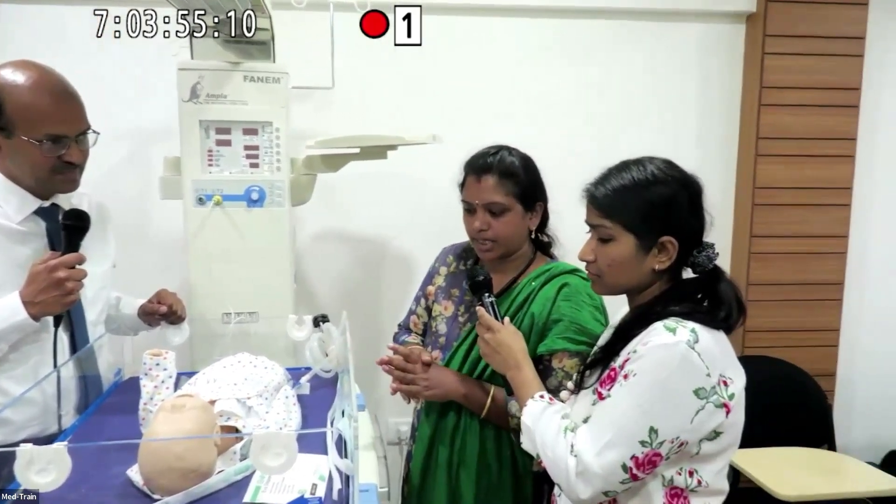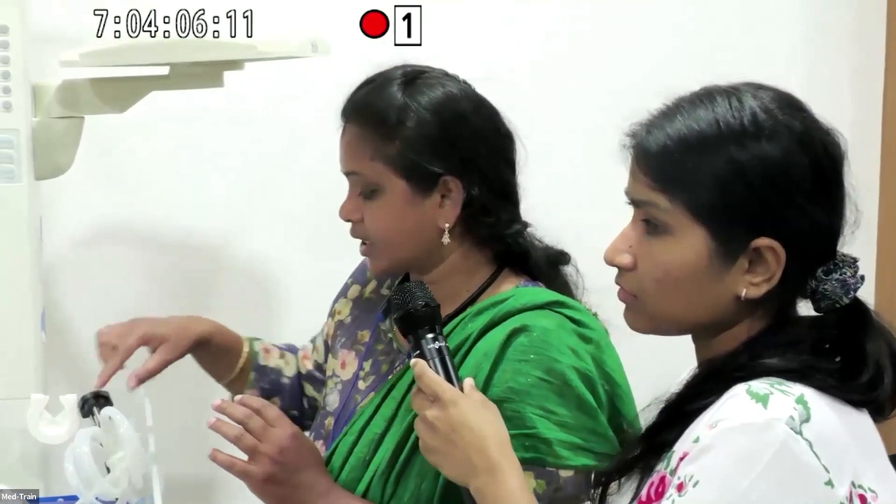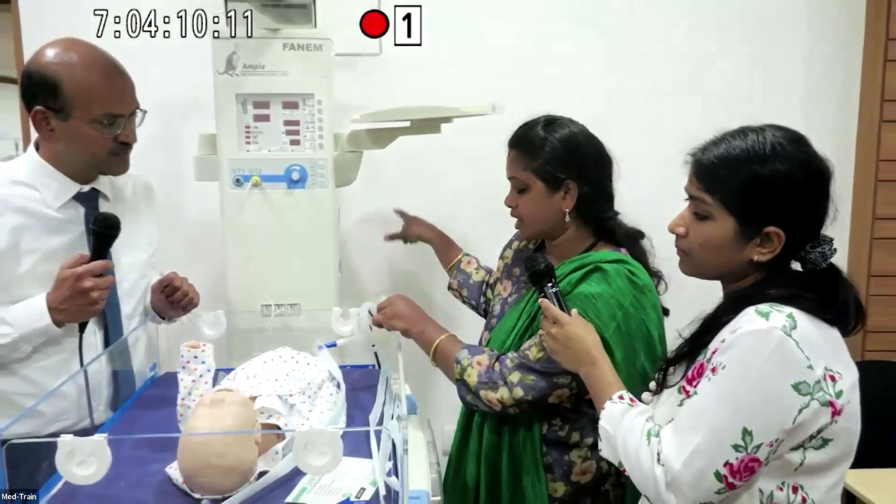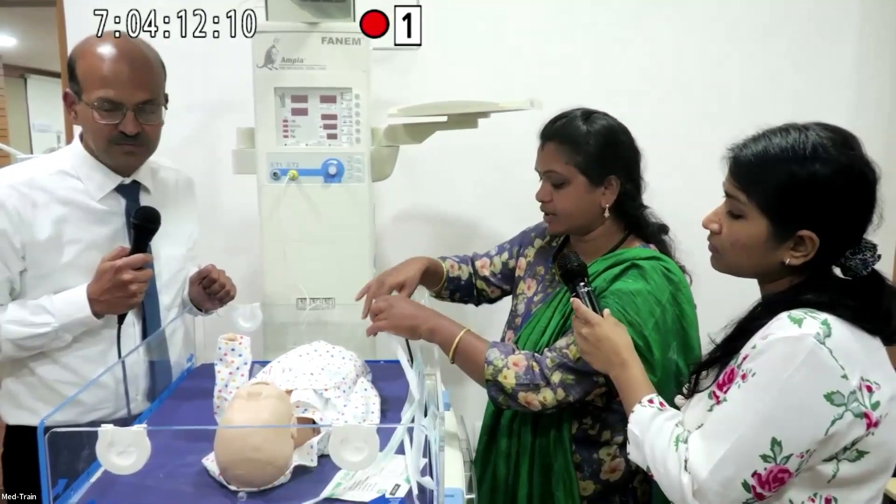Good evening everyone. Before suctioning, the first step is hand washing. After hand washing, with clean gloves, you need to connect the suction catheter and keep it ready on the suction board.